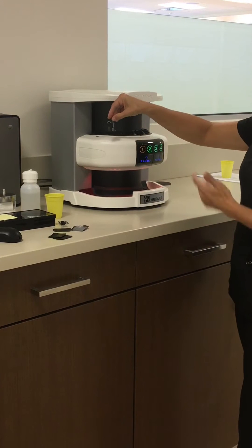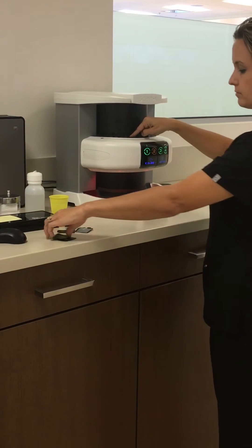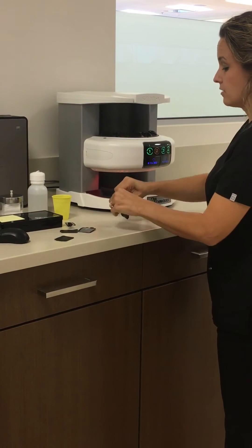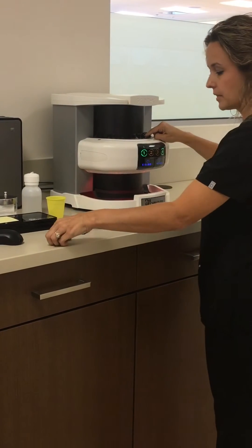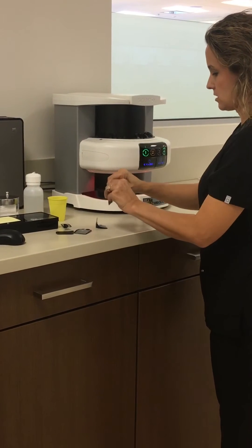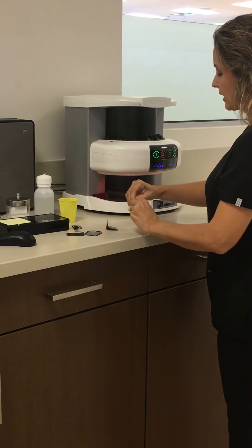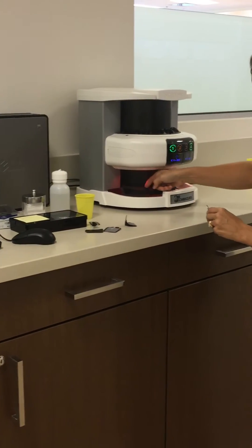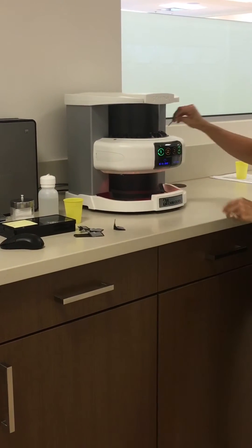Always orient the plate with the letter facing toward you — letter side towards me — and black side out when scanning. Apply gentle pressure and the ScanX will receive the film. For demonstration purposes, I just have five PSPs to scan. The plates will fall down into the bottom of the scanner. Sometimes they get stuck behind the rubber gasket, so make sure you retrieve all of your plates.